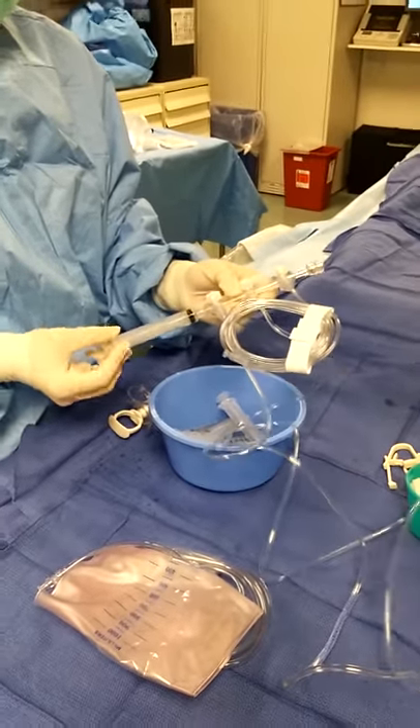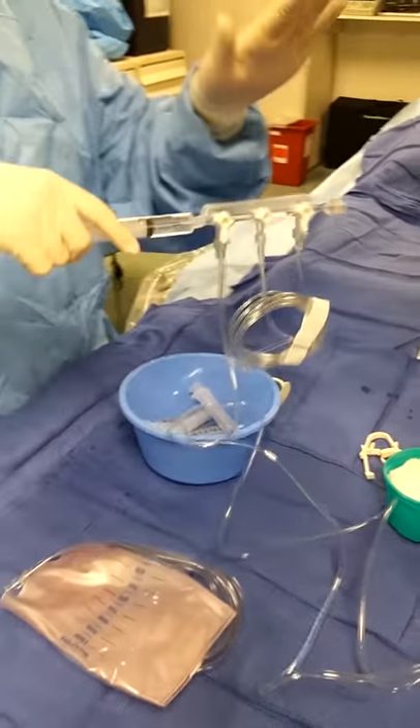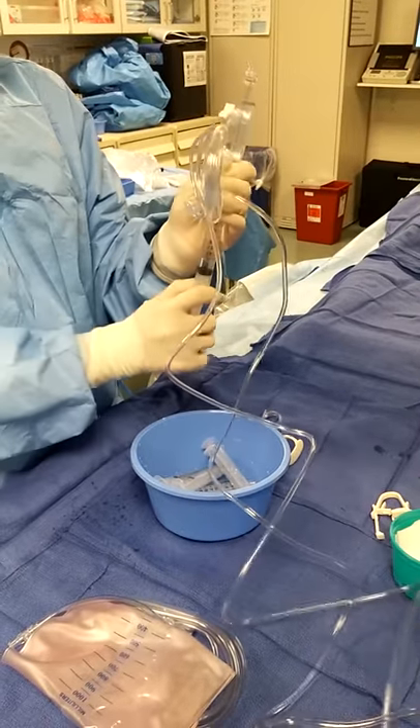I use a 10cc syringe. I don't use the control syringe — that's what this is. The manifold is going to be your setup.